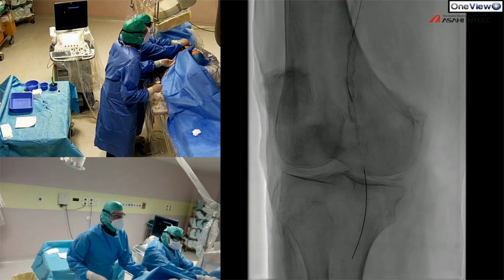If we try to define the position of the system in the middle of the calcium, it is not in the middle. So probably we are in the true lumen, but we cannot be sure to be always in the true lumen. We are very, very close to the external edge limitation of the calcium in that area, but probably we are in the true lumen.